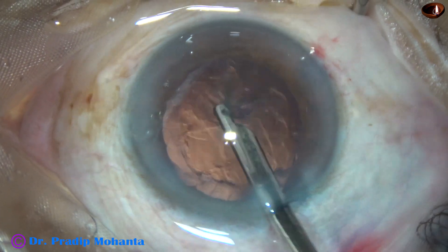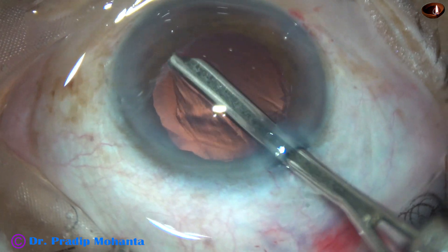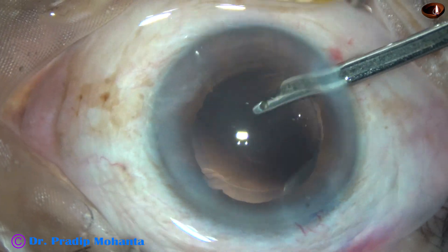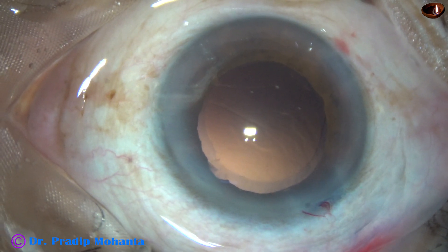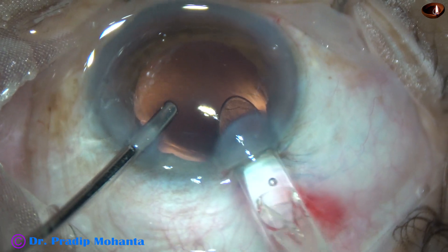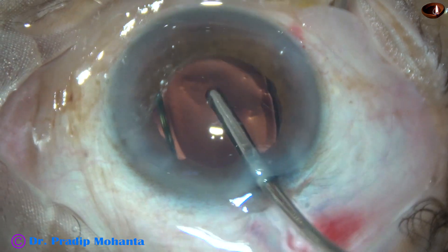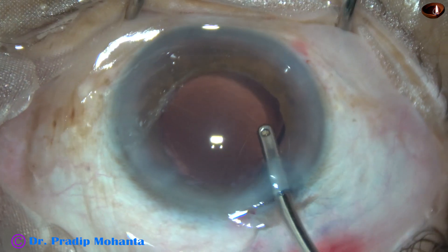Now cortical cleanup is being done quickly with this instrument — this is a 23-gauge Simcoe. All the cortex has been removed except a speck sub-incisionally. A little bit of polishing of the posterior capsule is done, and then a hydrophobic acrylic single-piece monofocal intraocular lens is implanted under irrigation, keeping the anterior chamber formed by an irrigating cannula. The lens goes into the capsular bag, and now this is anterior chamber lavage.